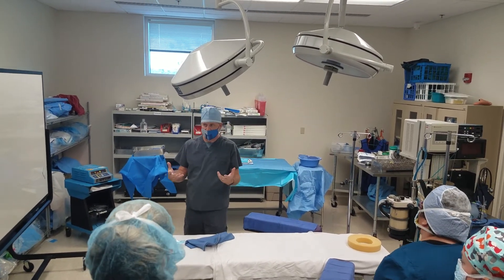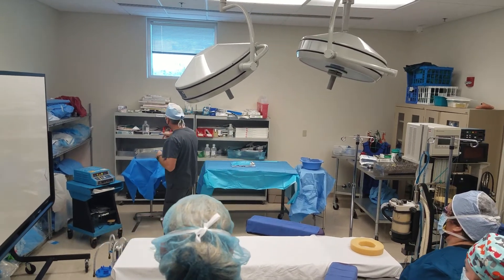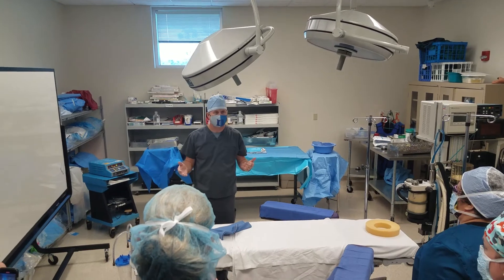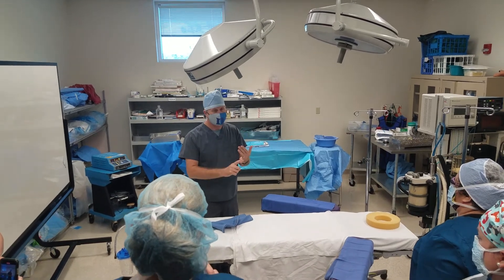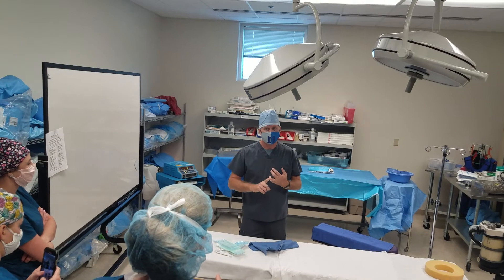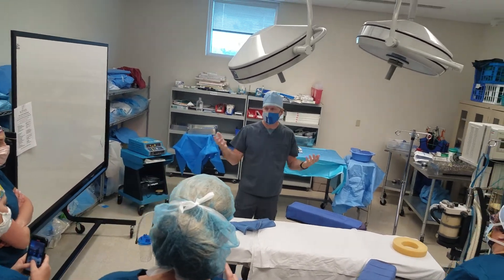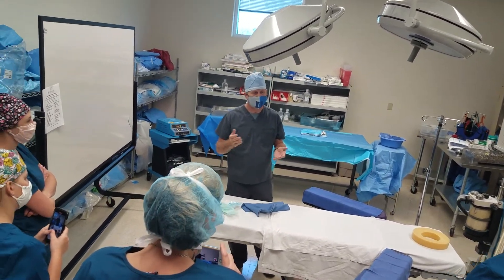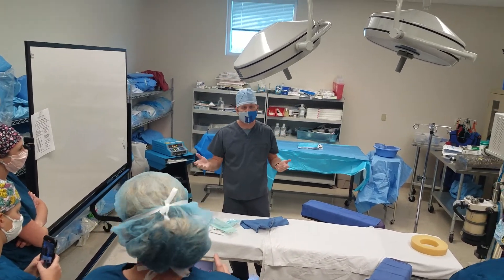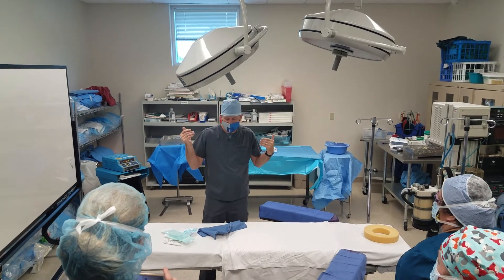At some point after you're gowned and gloved, you can poke around in there and try to find it. If you still don't find it, you can't use the instrument set. Plus, since you've touched it, your gown and gloves have been contaminated and you have to change. If you can't find an indicator, you have to throw it out. If somebody was careless and didn't put one in there, too bad — we don't use it. And that does happen.